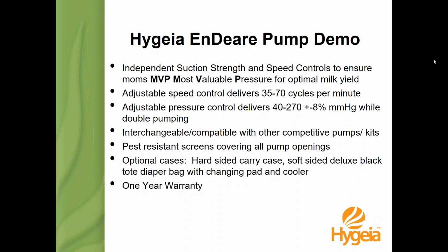This is our removable flange that I told you I would explain later. We just changed this last fall, so there was a patent on it that didn't allow us to disconnect this, but that patent has passed, and so therefore, if we want a larger flange, we'd simply replace this with a larger flange. And yes, any of the larger Medela flanges will work in there. Okay. All right. So we've got our 2 bottles. Set those aside.